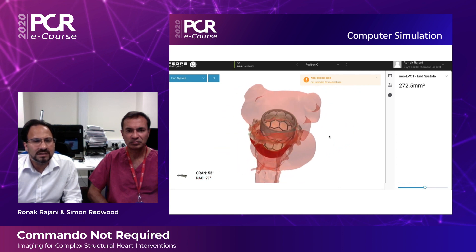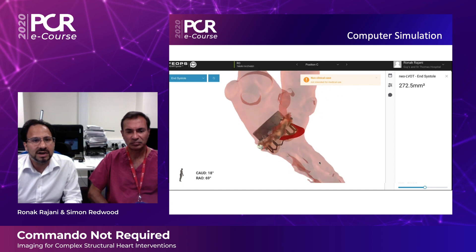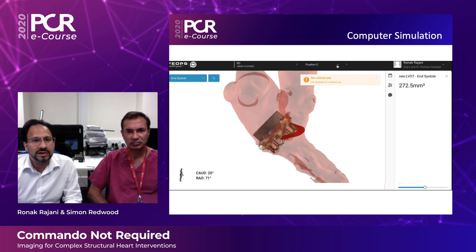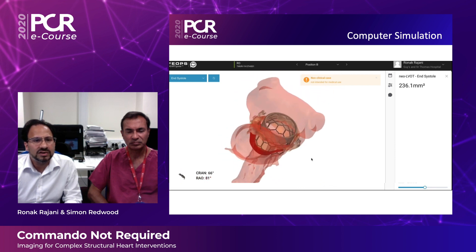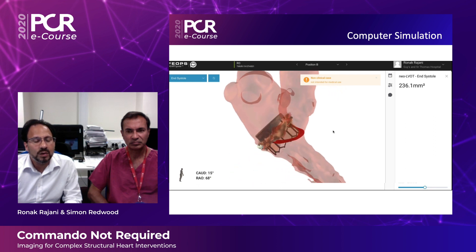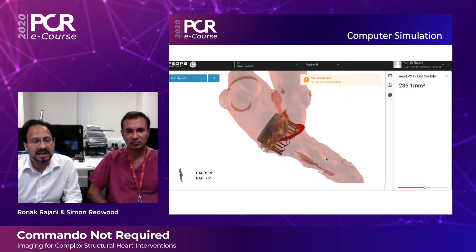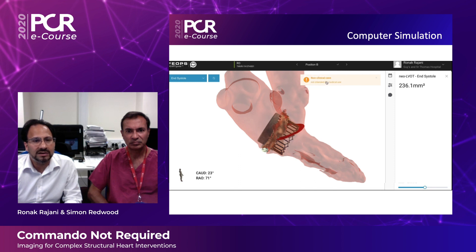Using the pre-specified 29mm Sapien III valve, we are able to virtually implant this onto the pre-procedural CT data set at various different heights. On the top of your screen you will see us shifting from position C to position B and then to position A, and on the right you will see the predicted neo-left ventricular outflow tract area. This allows us to guide the interventional cardiologist on the optimal deployment zone and the likelihood of neo-LVOT obstruction.